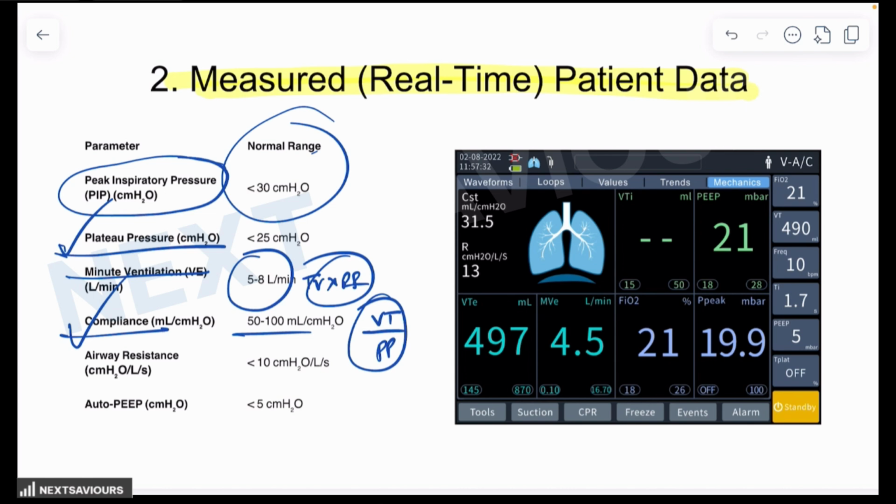For example, if the pressure in the lungs keeps increasing to an extent that it might lead to alveolar rupture, because of the low compliance of the lung, then in that case you have to maintain the pressure on the lower side. And there comes the importance of the modes in which the ventilator settings are kept, which we'll be talking about later.